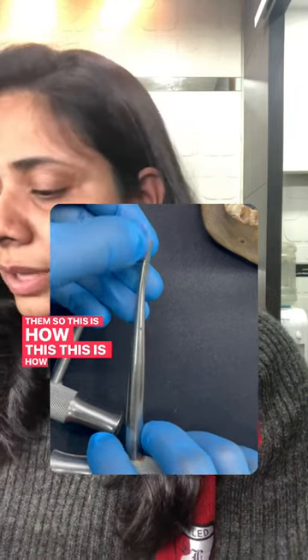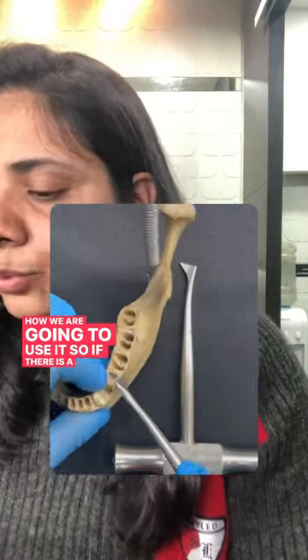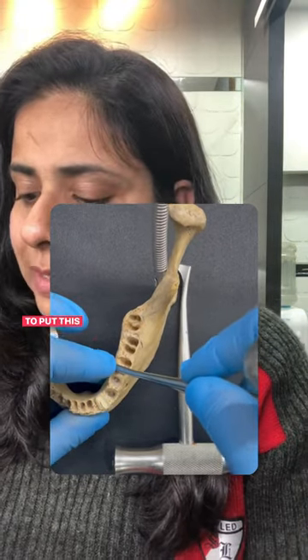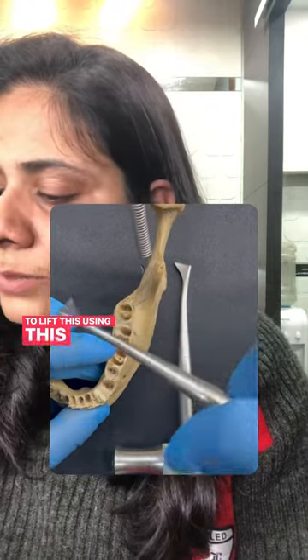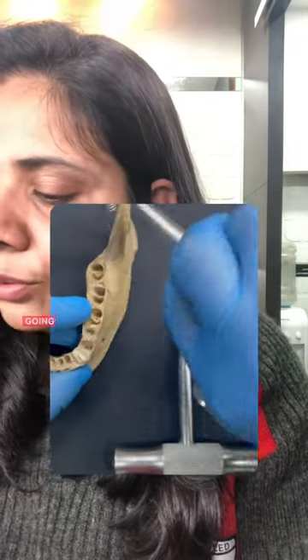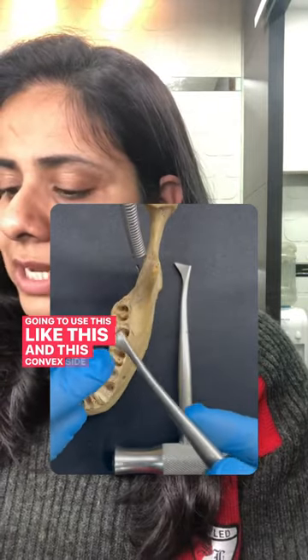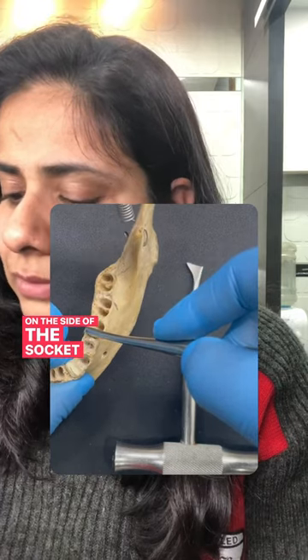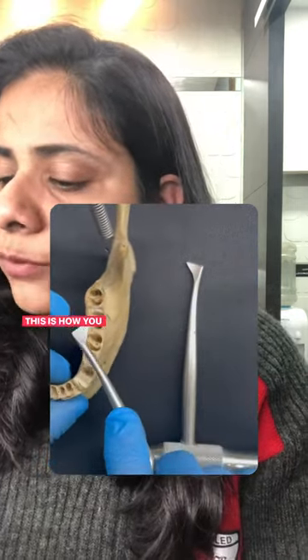This is how they look and this is how we are going to use them. If there is a root remaining in the distal socket, you are going to put this elevator on the mesial socket and lift it using the wheel and axle principle. The convex side should face the side of the socket and the pointed side should face the interdental bone — this is how you will place it.